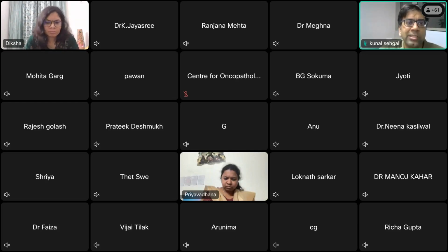We see this discrepancy very often. It shows plus or minus on the CBC machine, but in the lab software it becomes normal. So people reviewing the data on the machine do not have an idea of what is happening. So this is something very, very basic. We always inform that during the time of installation or later, when you identify the reference ranges are not similar in your lab software and machine, please get that done. That's going to be the first starting tool to identify.